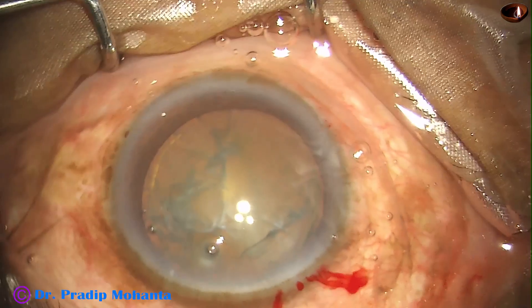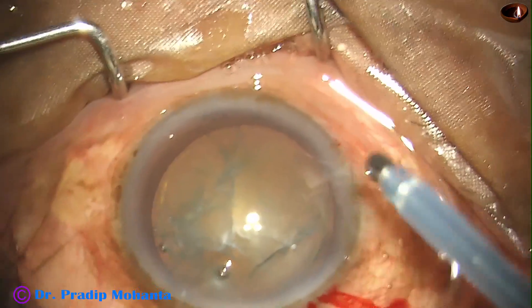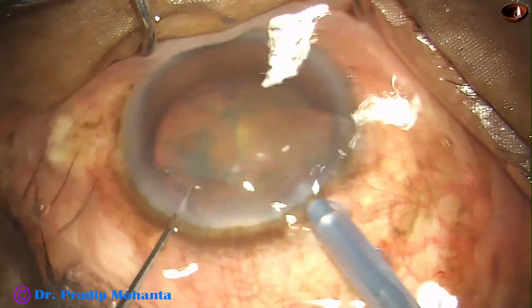By this time, hydrodissection has been done. And now the phaco handpiece is being introduced into the anterior chamber. Here it goes.